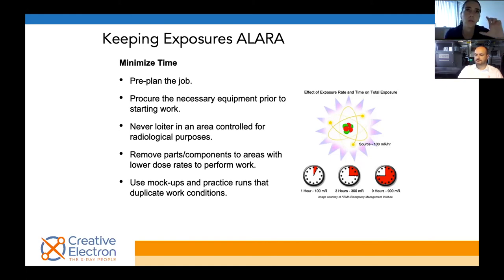There's typically one reference one that's kept in an office far away so that you can tell the effects really came from the machine. There's also usually one or a couple posted on the machine itself. But what happens with dosimetry badges is there's a lot of room for misuse. Anything like forgetting about it in the dashboard of your car, it's going to be exposed to the sun and the heat. That's going to throw off all your measurements. So if you have, for example, a heart stress test the day before, now you're radioactive and you're wearing your badge and you're tweaking with those numbers.